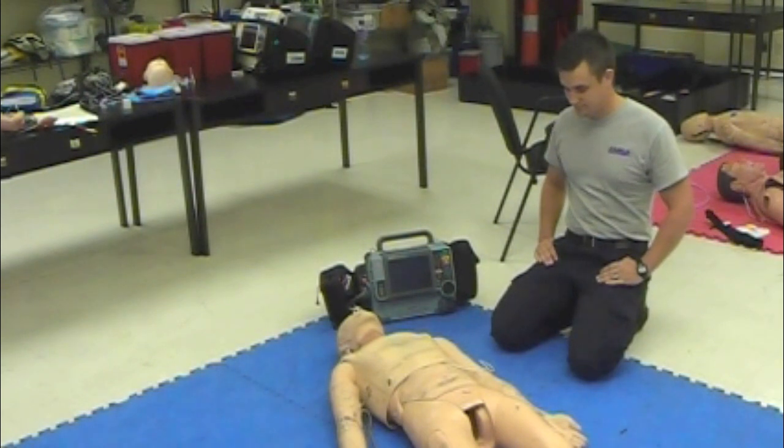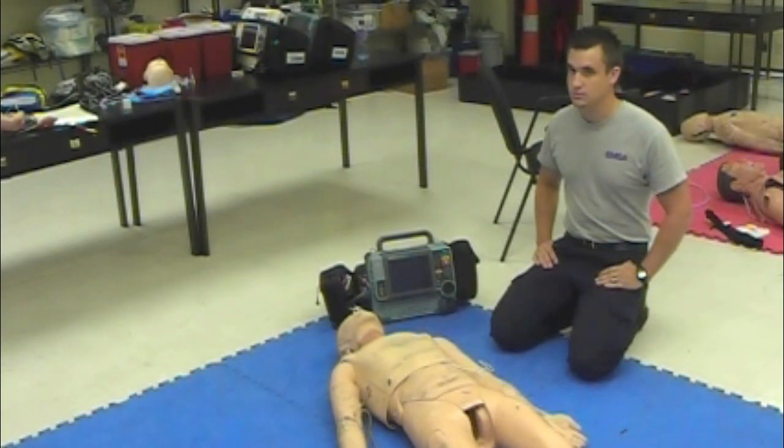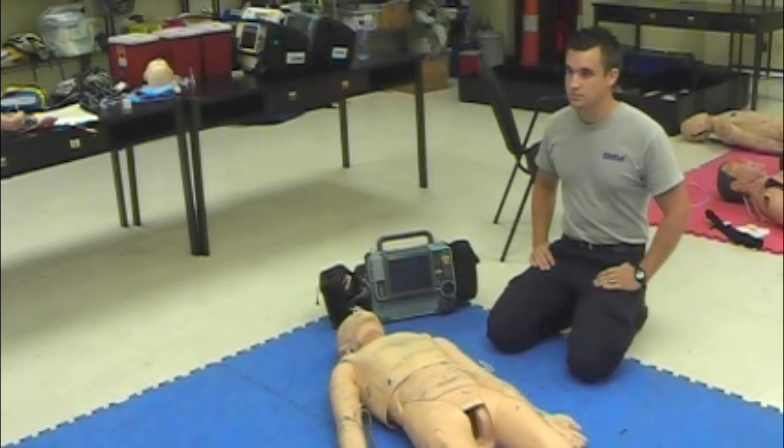All right, this is the dynamic cardiology station. In this station, you'll be tested on your ability to electrically intervene with the monitor, either cardioversion, defib, or pacing, whatever might be required for the patient. You verbalize all of the treatments, intubations, IVs, and medication interventions, and we'll push time along. Whenever you're finished with your interventions, I will tell you when 2 minutes is up and we'll move to the next phase of your management. So are you ready? Yes.